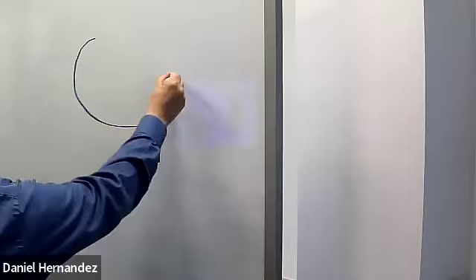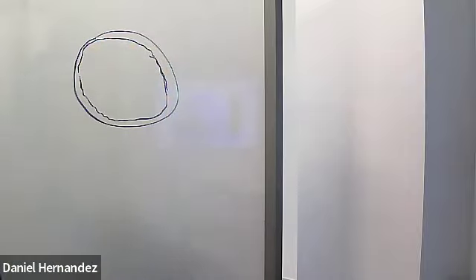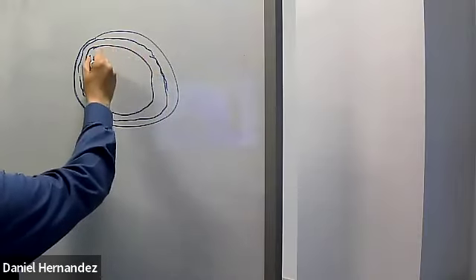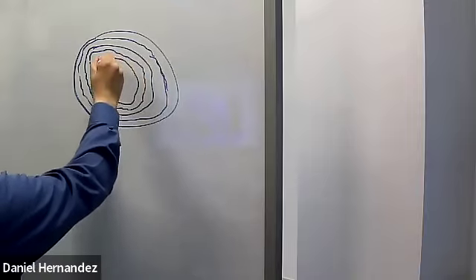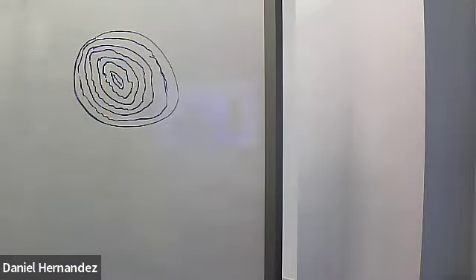This is just showing some dilated loops of bowel. You've got your first loop of bowel, your outer layer, another loop of bowel in between, in there another loop of bowel, maybe the third one or fourth one. So in transverse, that's going to be your intussusception.